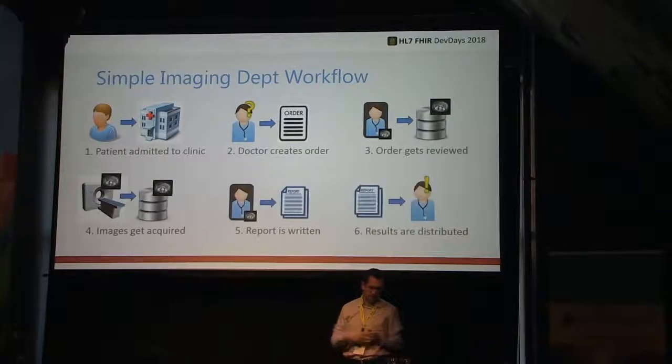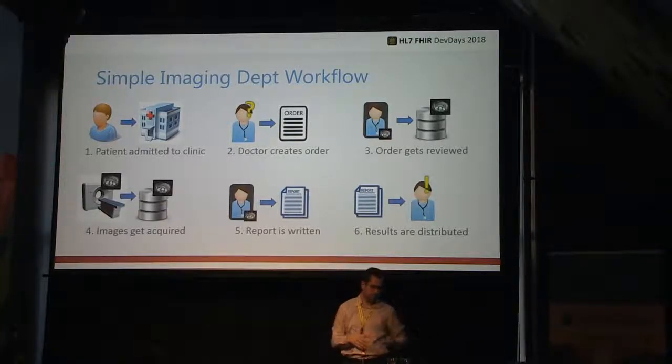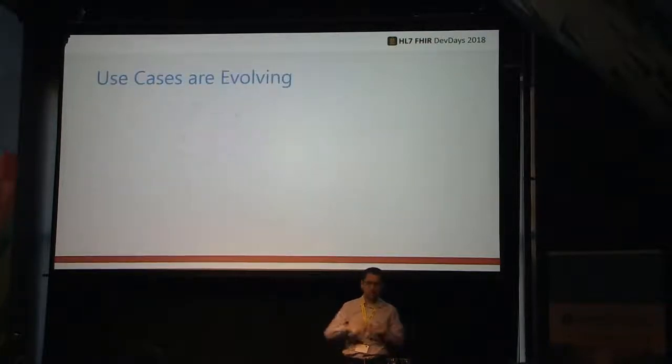Just a quick recap. A typical imaging workflow looks like this, right? You're admitted to the hospital, they create an order, the order is processed, your image is acquired, radiologist reads it, provides a report, and then that report is distributed around.